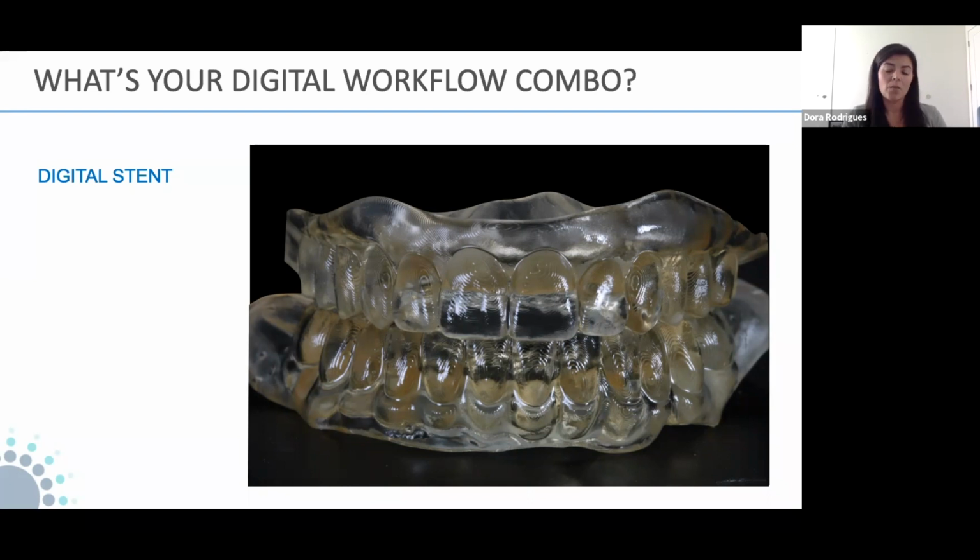Last time, on part one, we went over the traditional workflow, right? When you design your denture and then you design your stent, you process your denture and then you have to process your stent, which is basically duplicating your denture into clear material. So if you remember, or if you didn't see part one, doing that stent is time consuming. It's tedious, it's not difficult, but you only use it in the mouth for about 10 minutes, and there's so much work to doing it, because you have to duplicate the denture and then inject clear acrylic and then finish, and then still open the holes for the windows for the multi-unit abutments, and it takes a lot of time.